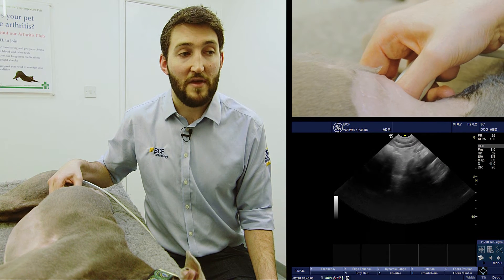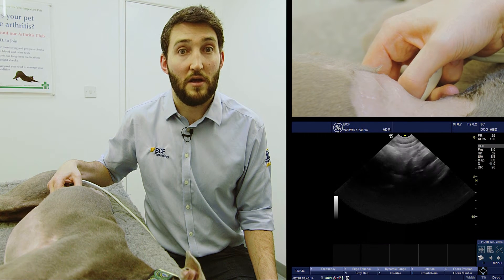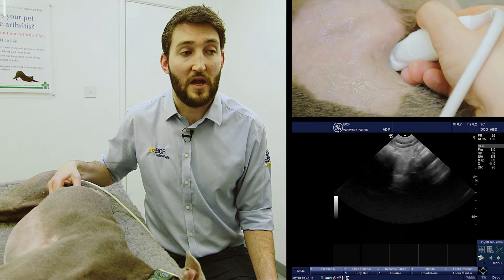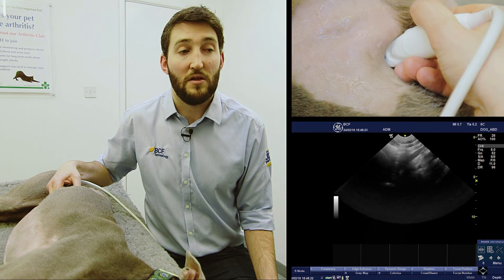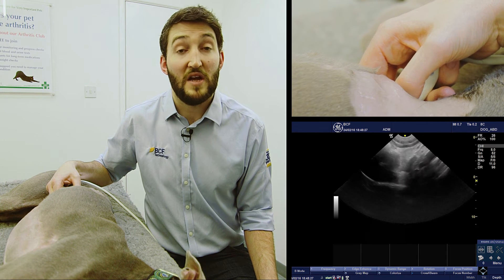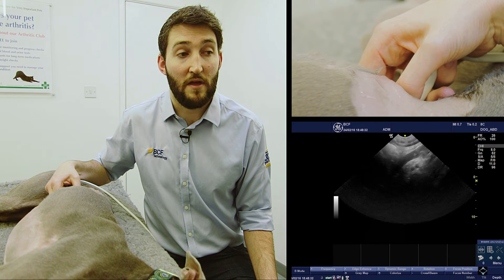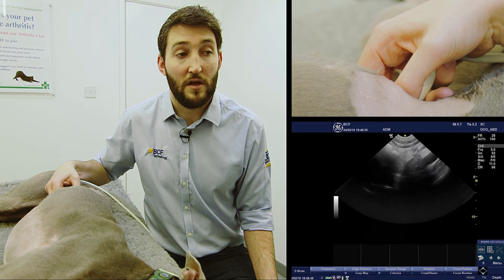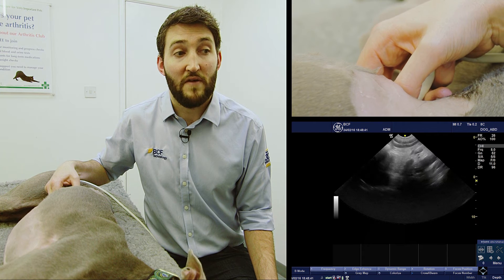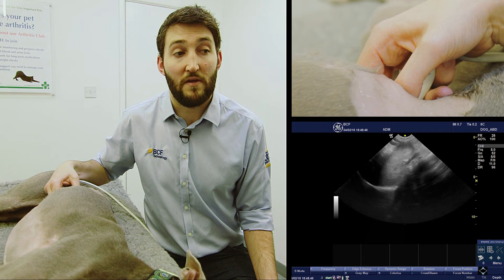Once we've found the vena cava, we're going to stop, then go back the way we came, looking for the adrenal gland popping up in the image before we get back to the aorta. It's a tiny fanning movement just off the vena cava, and just there — although we are getting some intestinal gas shadowing — you can just make out the right adrenal gland. Having just fanned off the vena cava, there is our right adrenal gland. Fanning ventrally brings in the vena cava; fanning dorsally, there's our right adrenal gland.